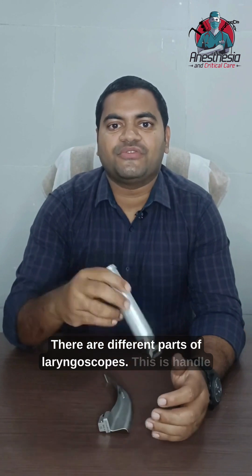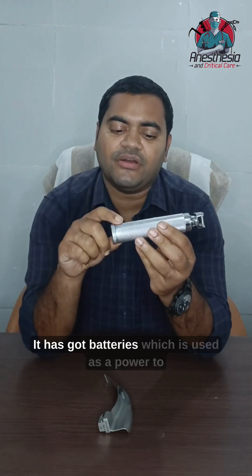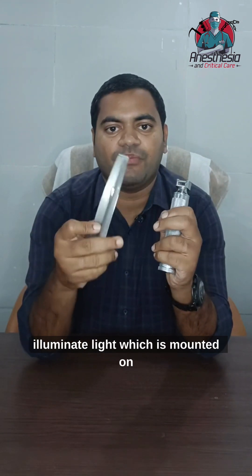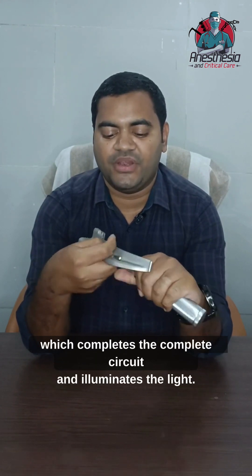There are different parts of laryngoscopes. The handle has a rough grip useful for handling. It has got batteries which power and illuminate a light mounted on the blade. The handle accepts the blade with a metal connection which completes the circuit and illuminates the light.